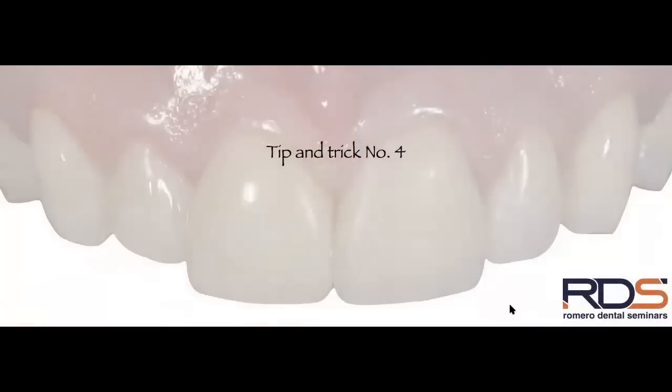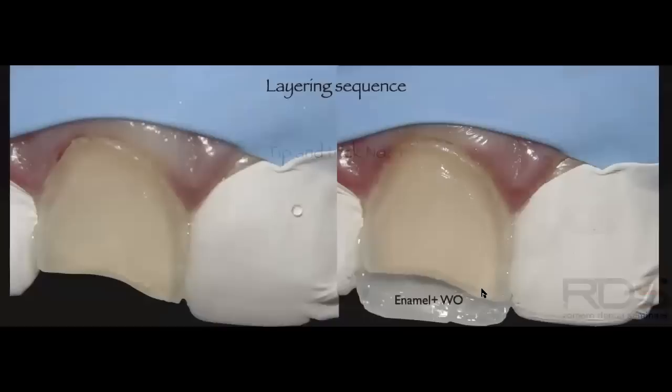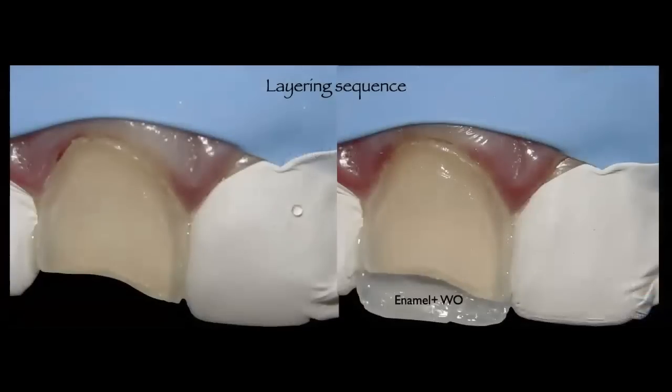Tip and trick number 4. So what is the layering sequence? How do I go about layering? And I'm going to walk you through the process of the actual case that we started with. That single central number 8, that we're going to remove the old restoration and we're going to redo a restoration.